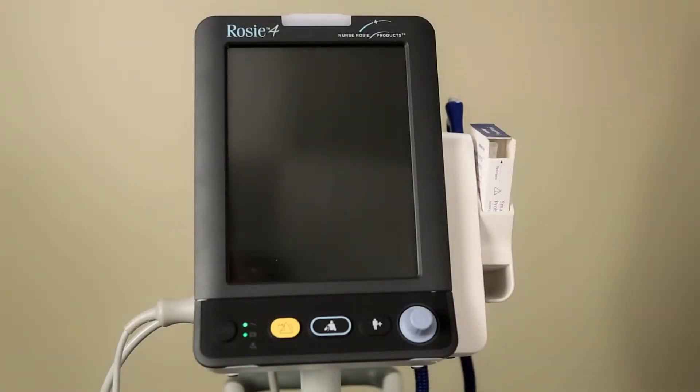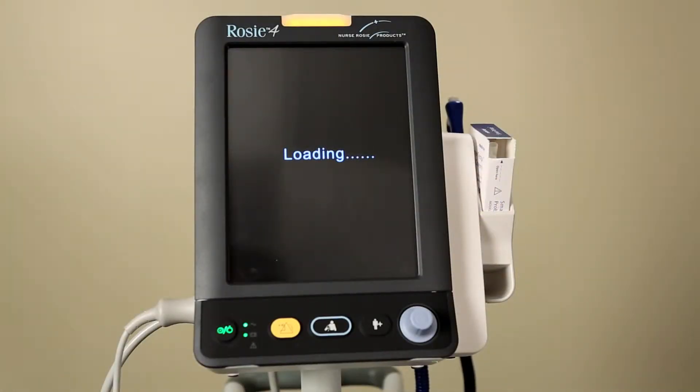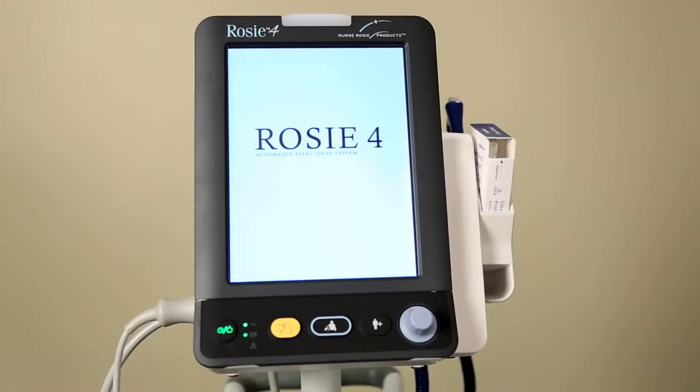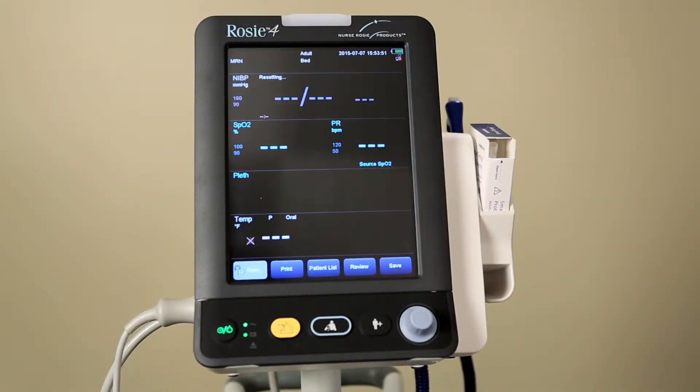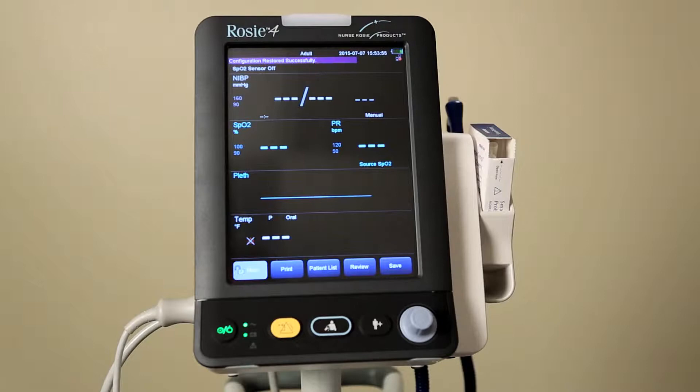The monitor will perform an alarm system self-test during startup. After pressing the power on/off button, the system will beep and the alarm lamp will turn yellow, then red, and then turn off, with the startup screen being shown. When the startup screen disappears, the alarm system self-test has succeeded. The monitor then enters the normal monitoring screen.